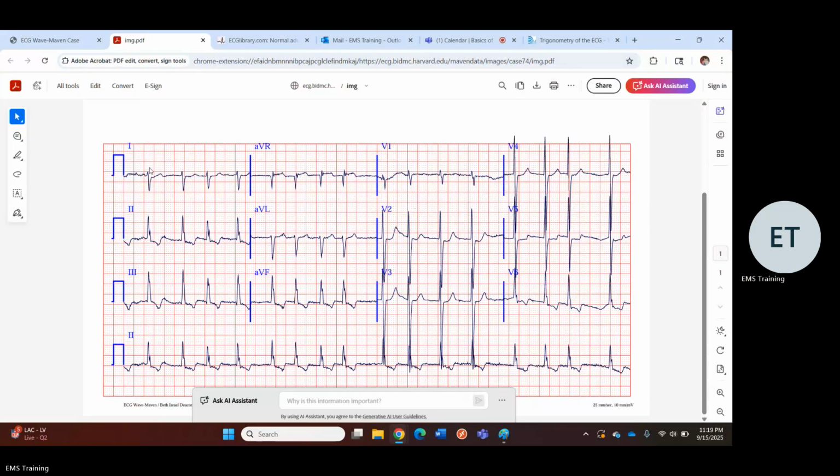And then let's talk about the axis. Lead I, thumb down. Lead aVF, thumb up. Which way is the thumb pointing? The right is thumbs up. So what is it? Right axis deviation. So with right axis deviation, let's talk about the precordial transition.